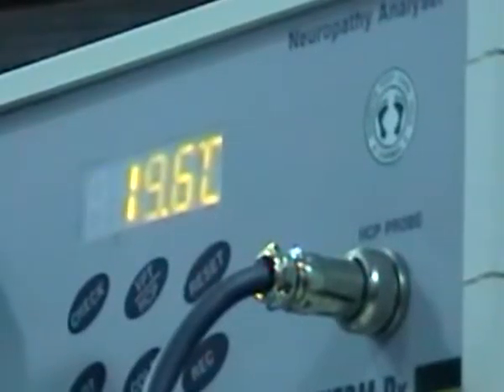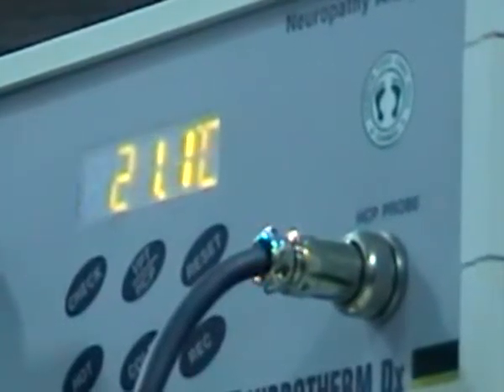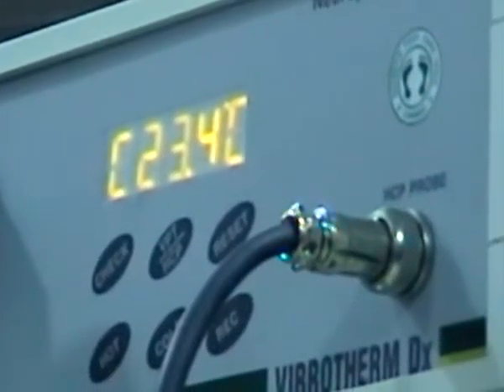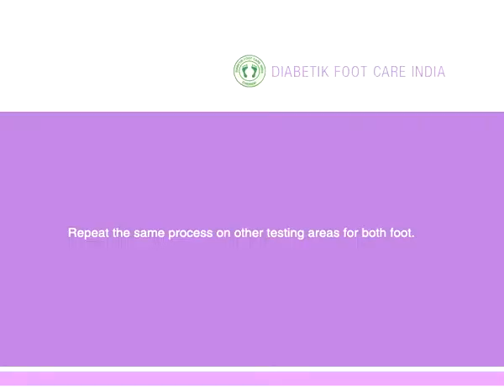When this key is pressed, the temperature is raised by 4 degrees above the current temperature. Repeat the same process on other testing areas for both the feet.